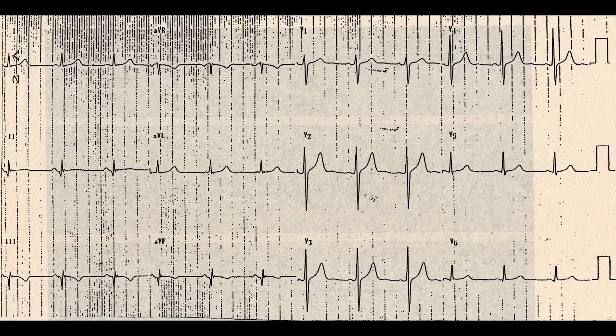And the standard, almost all the time, you're using 10 as your standardization. There are 2 other possibilities. You can actually set the machine at 1 millivolt equals 5, and this will make everything smaller. And so if somebody has big waves that go off the sheet, for example, you can make them smaller, but then you have to mathematically convert. You're just making it easier to read. Or let's say you have real small EKG waves. You can actually set it to where 1 millivolt equals 20, and then you make the EKG bigger and easier to read.